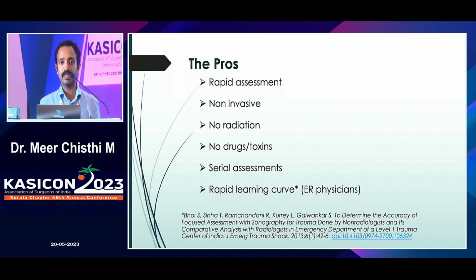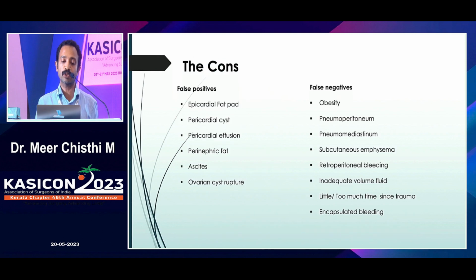So what are the advantages? You can do this as much as you want. It is rapid, non-invasive, no radiation, no toxins, nothing. And it can even be done very well by ER physicians. This study came up from our own All India Institute of Medical Sciences. It is 100% efficient in the hands of ER physicians.